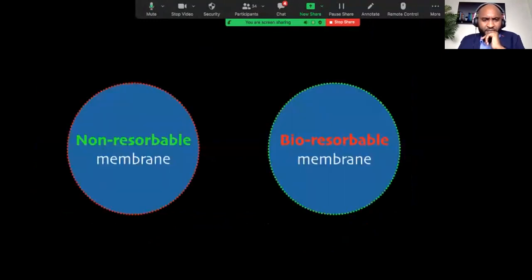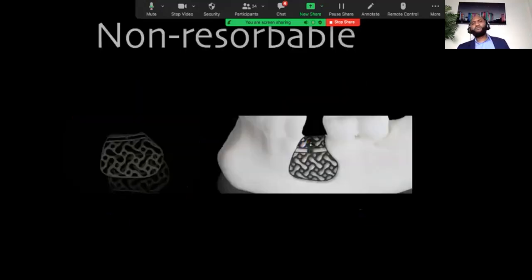They are either resorbable or non-resorbable. In other words, some are degraded by the body. Others you will have to remove. So let's start with the non-resorbable. Traditionally, and I know you've probably all come across this, non-resorbable membranes were mainly made of titanium meshes.